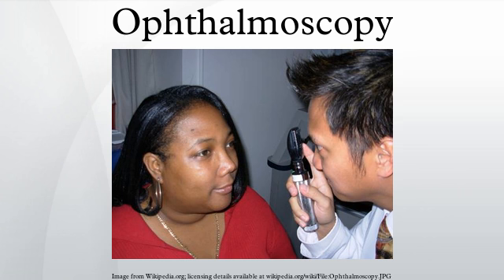Dilation of the pupil, to allow for better inspection through the pupil, which constricts because of light from the ophthalmoscope. It is often desirable to dilate the pupil by application of a mydriatic agent, for instance tropicamide. It is primarily considered ophthalmologist equipment. Recent developments like scanning laser ophthalmoscope can make good quality images, though pupils as small as 2 mm, so dilating pupils is no longer needed with these devices.